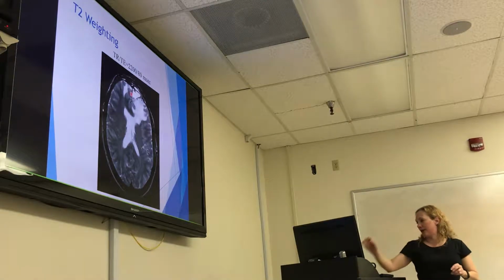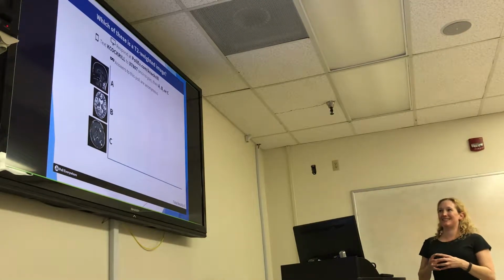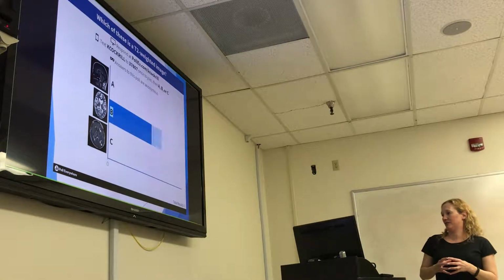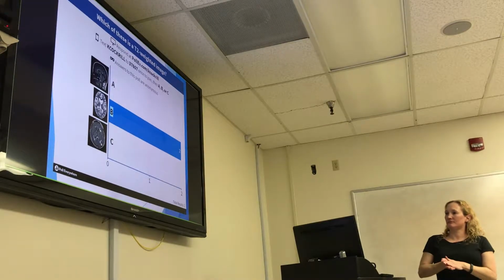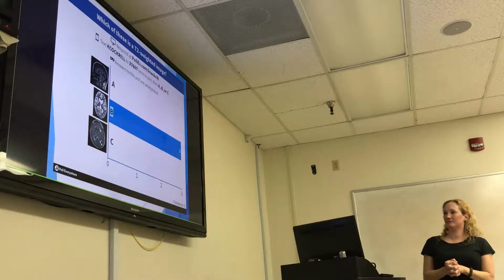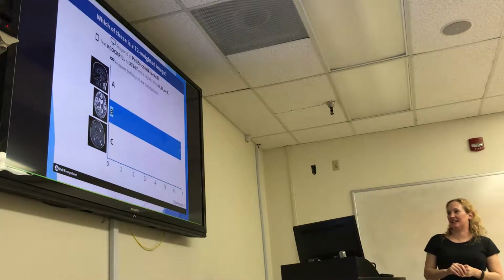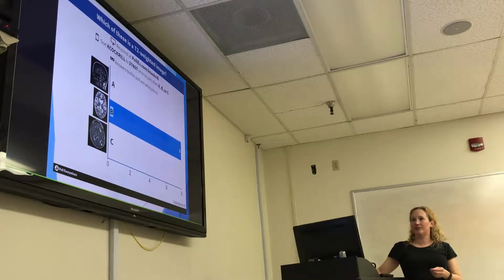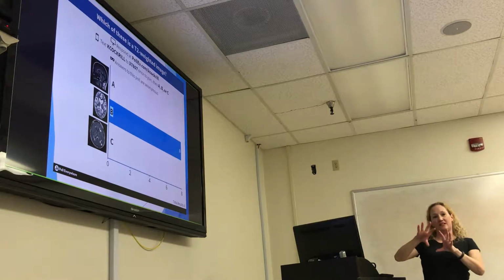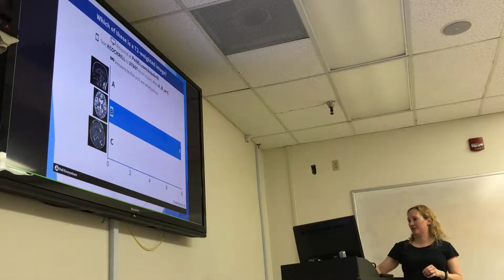Great, guys. Okay. All right, so now, which of these is the T2 weighted image? Good, I'm liking the consensus on this one. Excellent, yes. So we can see that there's the bright fluid in the center, the CSF, and then you've got the darker fat around the periphery. So yes, the answer is B.